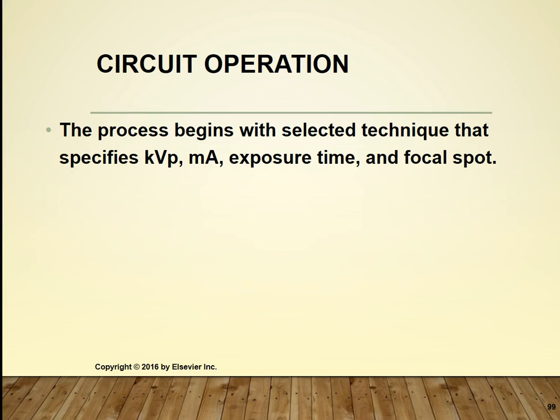The appropriate place to begin is the operating console, just like in an automobile. Options and arrangement vary. If you go to 3 different clinical sites and they have 3 different instruments, they all have the basic options in common. The operating console offers options for selecting your kVp, MA, exposure time, and focal spot.